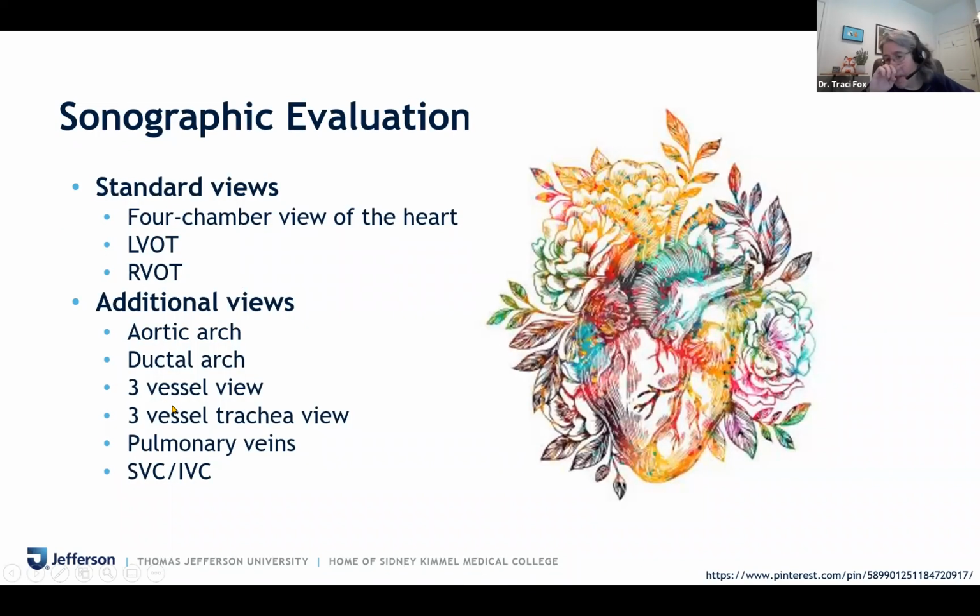One important reason, let me go back, one important reason, by the way, that we do these 3 particular views, even when they come back at 28 weeks, 32 weeks, assuming the fetal position and size allows it, is because the heart is one of the things that can be totally normal at 20 weeks and totally abnormal at 32 weeks, 34 weeks. So these are the kidneys, the brain, the heart. There are certain structures that anytime a patient comes back for a growth scan, we should be looking at these structures because they can be normal and then not normal.